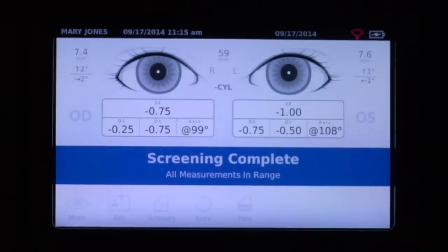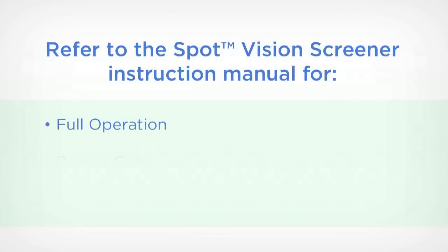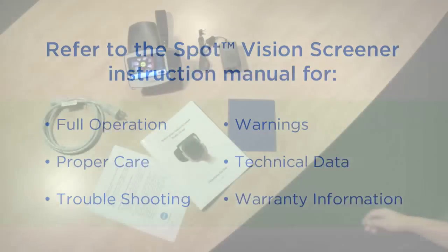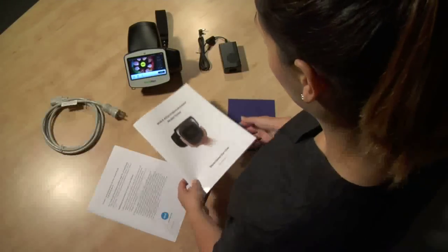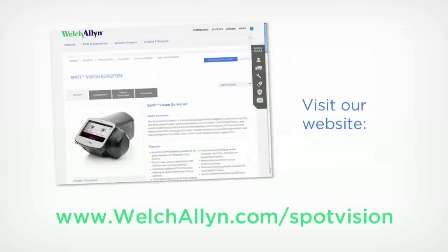In just seconds, Spot provides a comprehensive, reliable analysis that enables informed decision-making about the need for care with an eye care specialist. This quick-start video demonstrates the basic operation of your Spot Vision Screener. For complete details on full operation, proper care, troubleshooting, warnings, technical data, and warranty information, please refer to the instruction manual shipped with your device or visit our website.